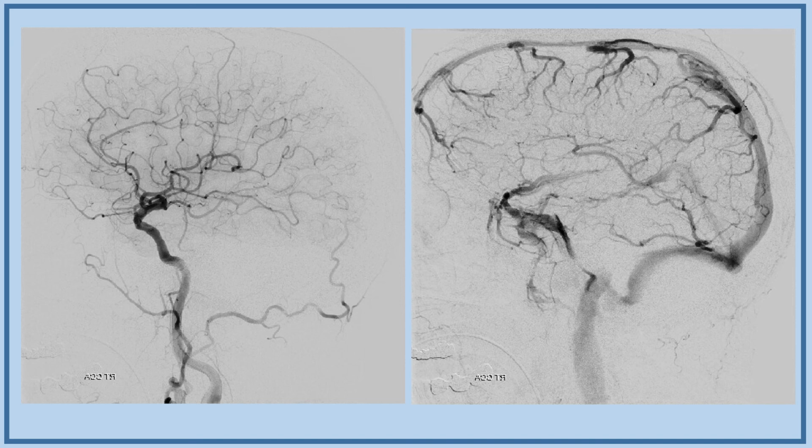Just look at that place 3, 4, 10 times. Not one time too many. And so that's the idea: a little bit distal catheter placement, safety first, and pay attention to those alternative sources.